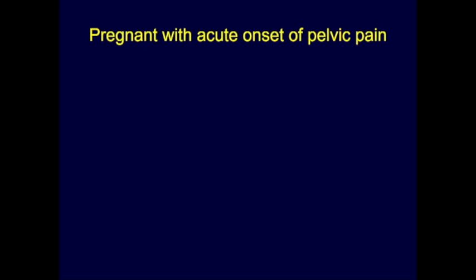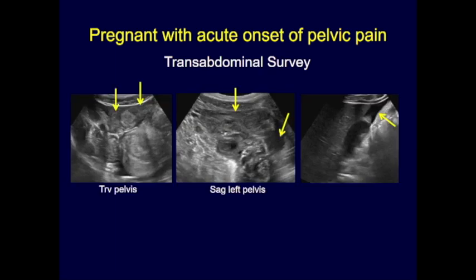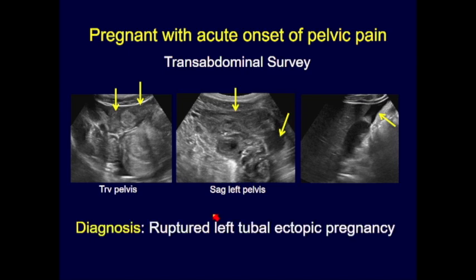Here's a pregnant patient with acute onset of pelvic pain. We always start with a transabdominal survey to get an overview: is there hemoperitoneum, are there pelvic masses? These images show very amorphous and complex-looking material within the pelvis outlining the bowel loops. There was no IUP visible, and there was a large amount of fluid in Morrison's pouch, confirming significant hemoperitoneum. This patient went to the OR and had a ruptured left tubal ectopic pregnancy — hemoglobin of 8, with 3–4 liters of blood in her pelvis.